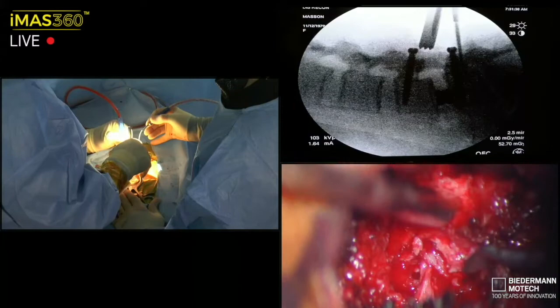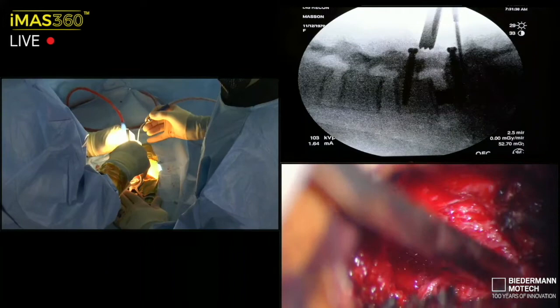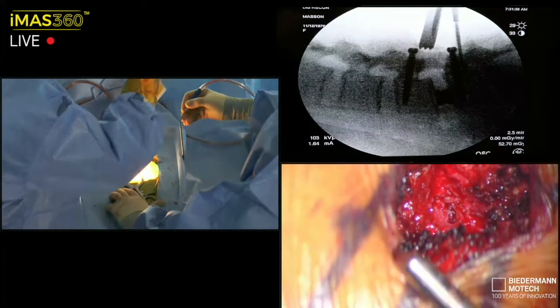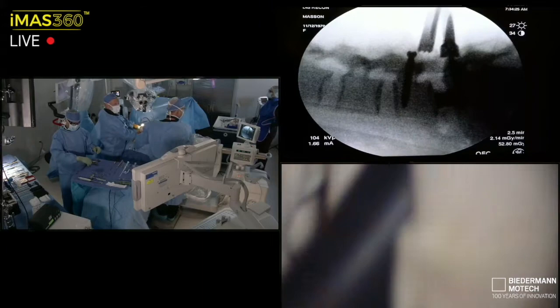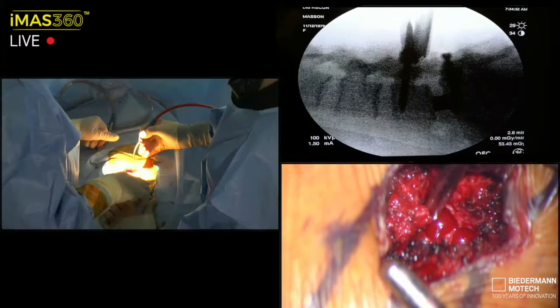So that's lateral thecal sac stuck. That's pretty severely stuck. I'm going to call it the point of diminishing returns and heightened risk. I've completely decompressed in the lateral recess, so I'm good. Let me have the reamer. We'll go to reaming the heads. Basically done with this. I ream the head, 5 left. 4 left, go to caps.